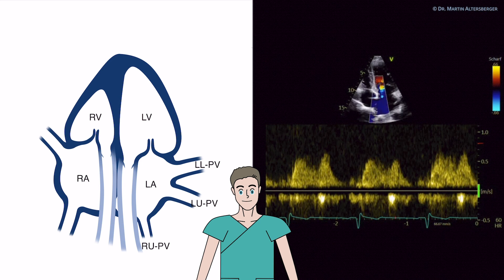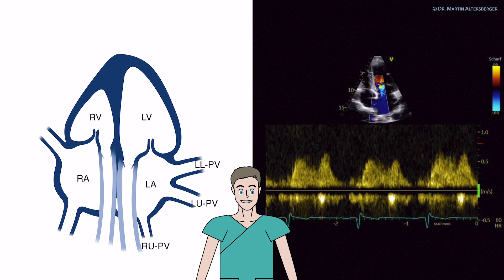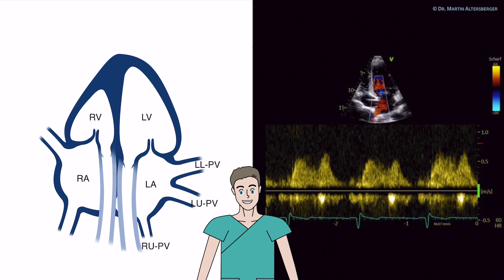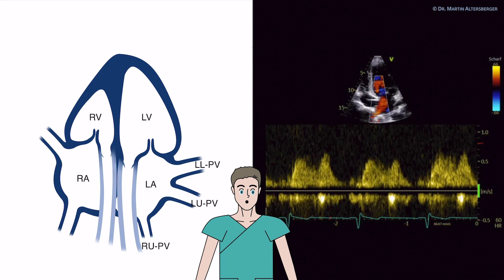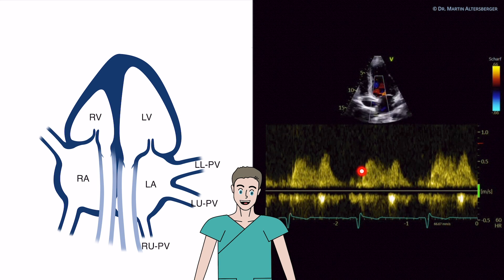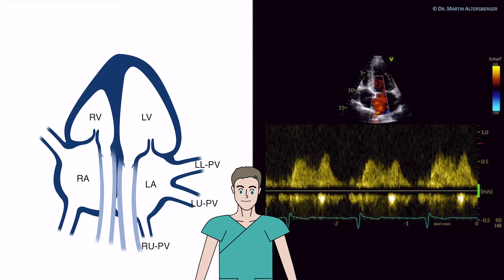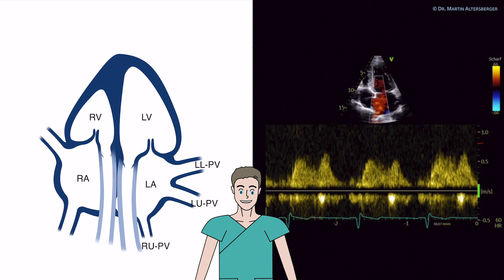We have an S-wave and a D-wave — a systolic and a diastolic wave. Sometimes there is an additional notch in the S-wave giving S1 and S2, but here we have a nicely depicted S-wave and D-wave. Normally the S-wave is larger than the D-wave. In this very young, healthy, and fit individual, the D-wave is a little bit higher than the S-wave, which can be a finding in young healthy athletes.